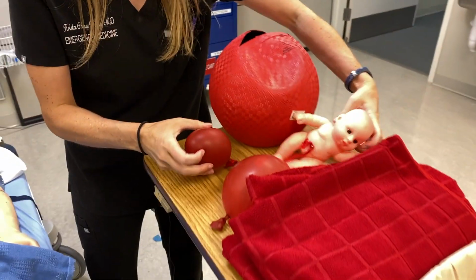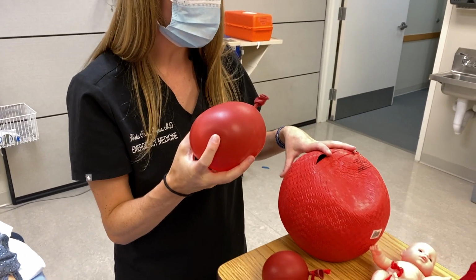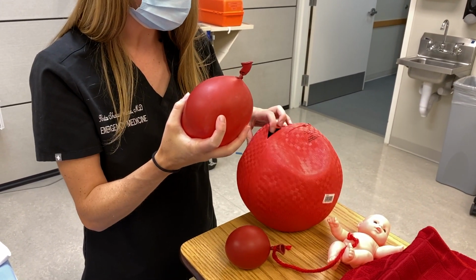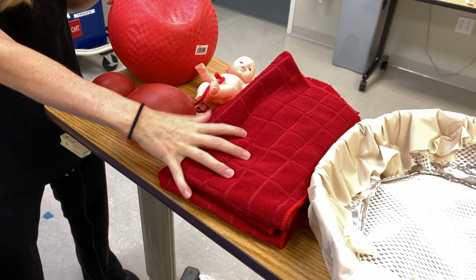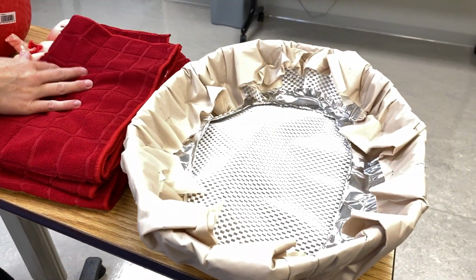Okay. And then in order to simulate amniotic fluid coming out when we open the uterus, I'm going to put a balloon at the bottom of the dodgeball. And then these will just be in our mannequin to help stabilize everything, which are just towels.